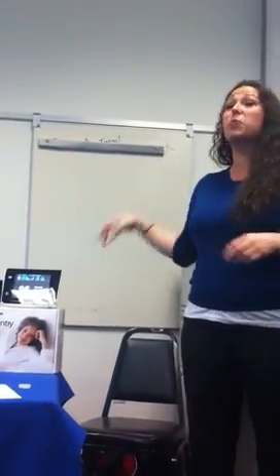So as you probably are already kind of familiar with the product, you'll have the monitor and that can be on the bedside, maybe of a parent who is monitoring their child that has diabetes. And that outpost will go in that child's room or in another person's room that's further away, so it can actually transmit to the monitor and from the pump. Okay, so that will work.